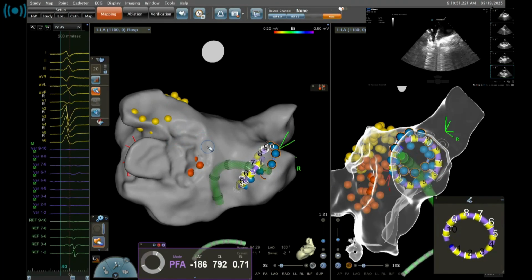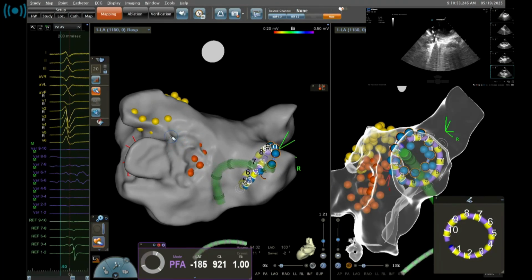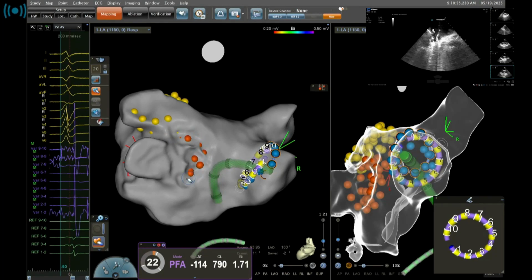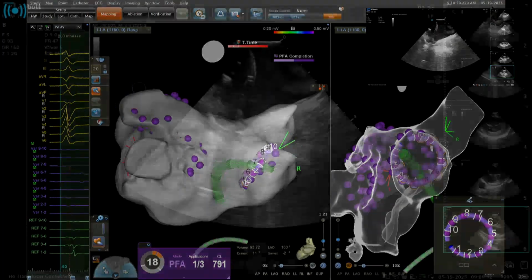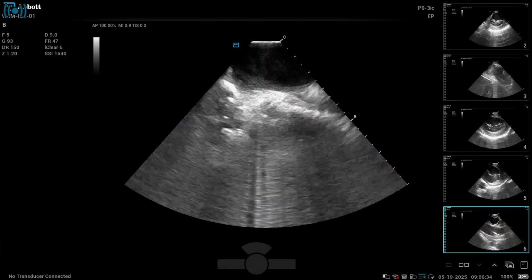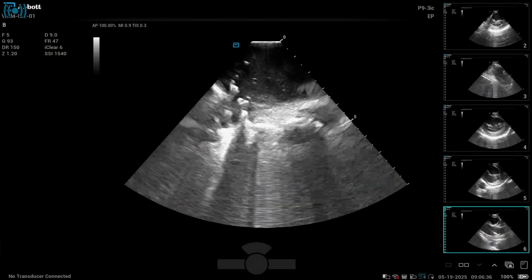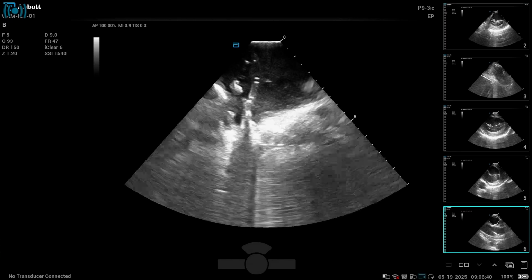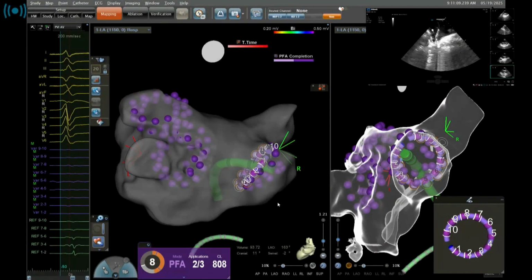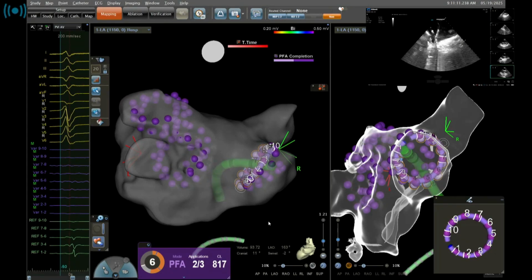Okay, that's excellent catheter position, well demonstrated. Go. We are a little bit more out. Yeah, we are in the antrum. When the atrium is very small, in this case, the transeptal puncture was done a little bit anterior on the fossa ovalis, and so we have more room to rotate from the fossa ovalis to right inferior. So it is easy to go here. It's easier when you have transeptal puncture a little bit more anterior.